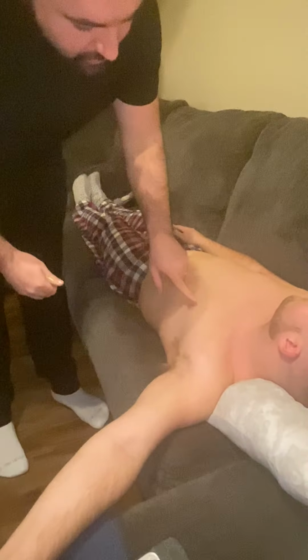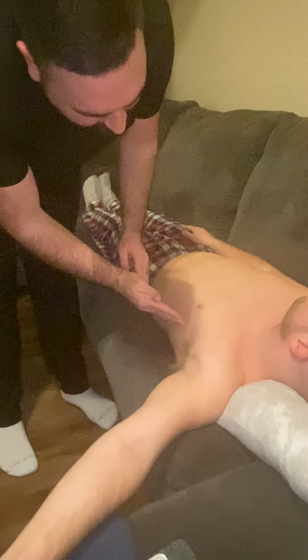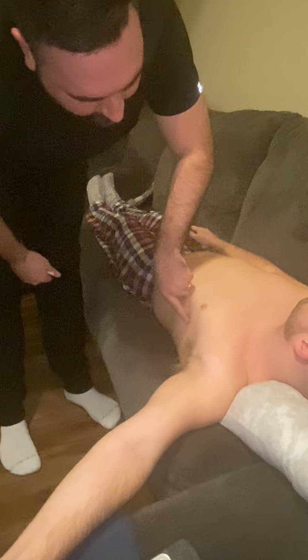The landmark that you're going to look for is the nipple, and then you're going to come over from the nipple to the anterior axillary line. So the nipple's here, the line's here. The chest tube insertion will be right here at the fourth intercostal space. You'd palpate it, and then you would use your scalpel and create an incision, and then you'd use your clamp and you would go up inside the thoracic cavity. Using that dull instrument, you'd continue to go up, and then you would slide your tube by your clamp until you were inside the thoracic space.